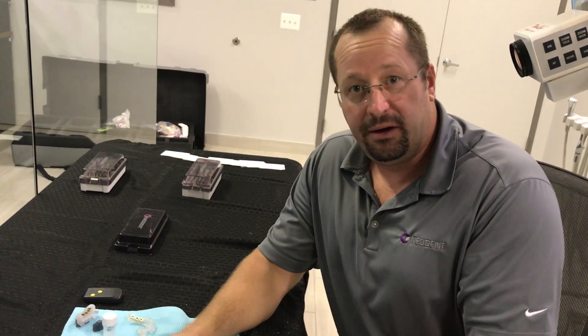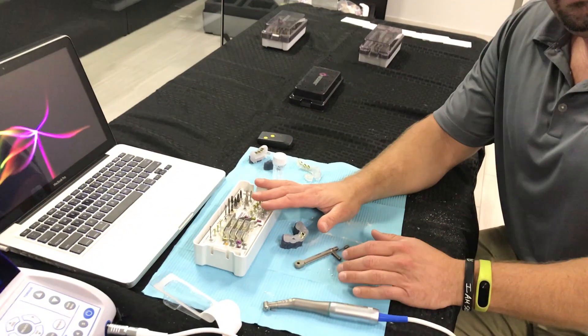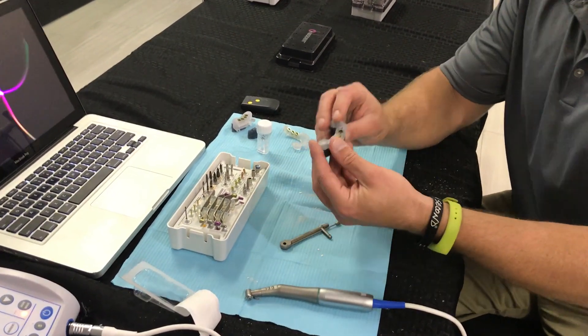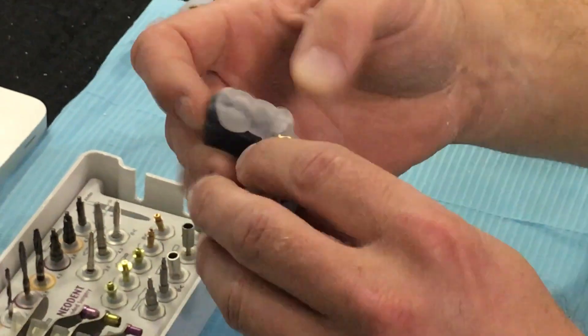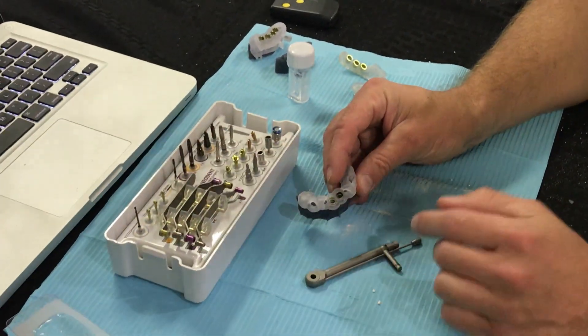We're going to go over the guided kit from Neodent and how to place an implant on a model here today with 3D diagnostics. We're working in the anterior region today on this tooth-borne guide and we're going to create our osteotomies utilizing this kit starting from the top.